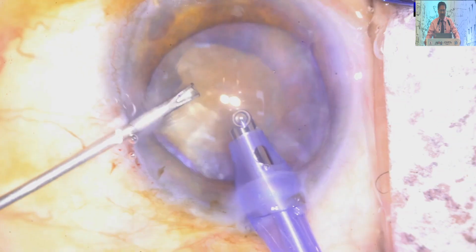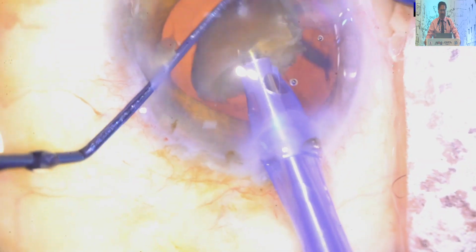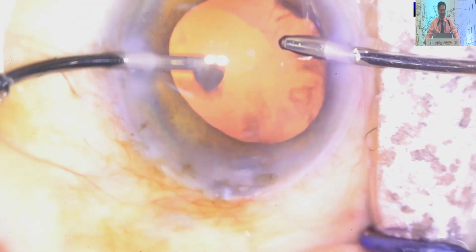This is a hard cataract. So many times in old age, you find this type of cataract. And in some cases, the capsular margins are fragile in intumescent cataract. So you have to take care of that also.